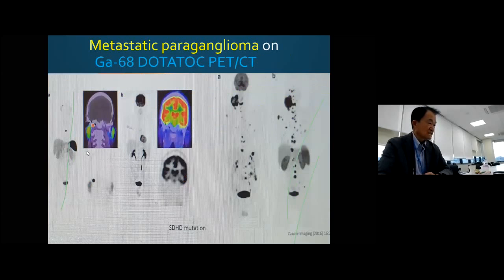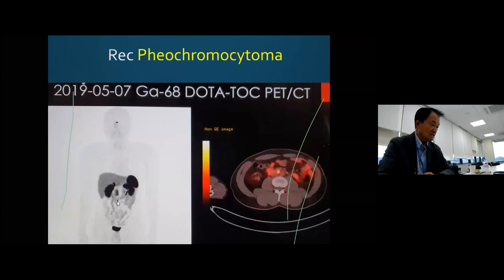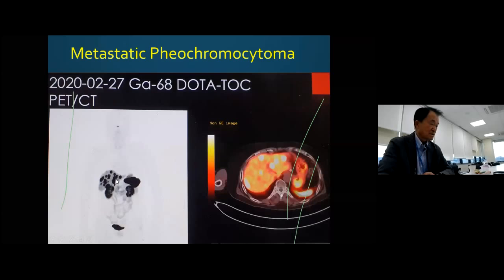So metastatic paraganglioma, you can see tremendous metastasis. From here, it shows a large lesion, but it doesn't show much intense uptake. Again, the intensity is related to receptor type and amount of receptor. And so this is a focal lesion, very focal, but very intense. And multiple lesions in the liver, very, very much so, this kind of thing.